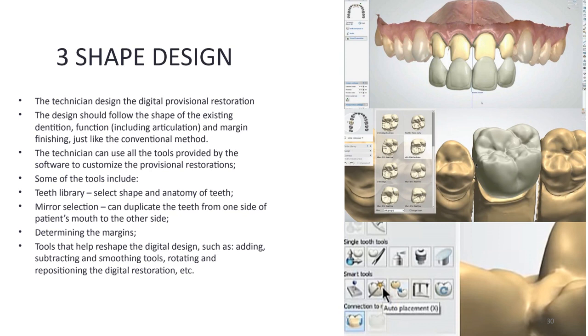What's good about using the digital method is that in the software, there is what's called a library where there are different digital shapes of teeth.